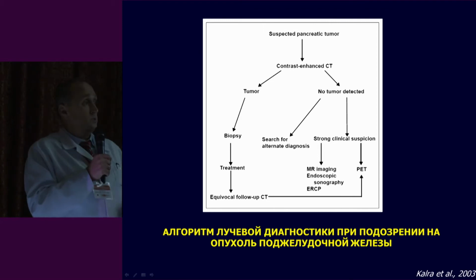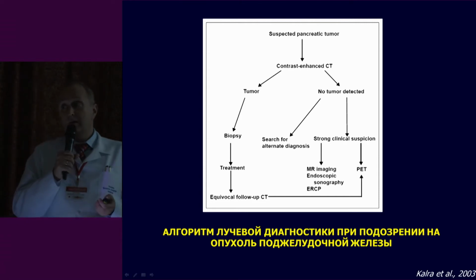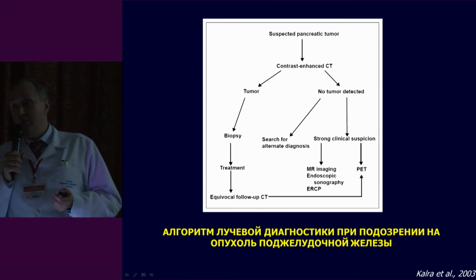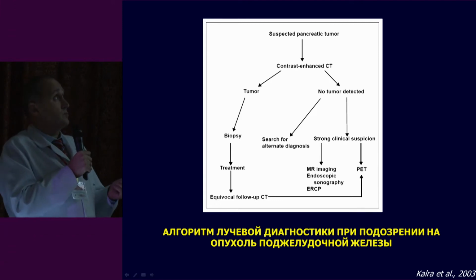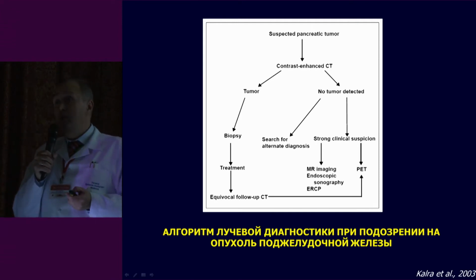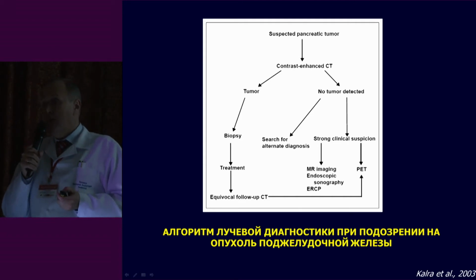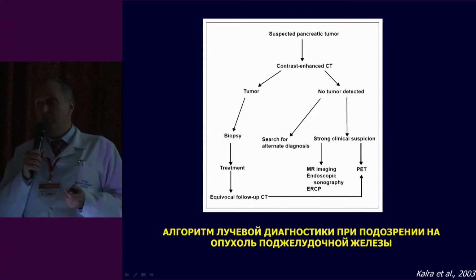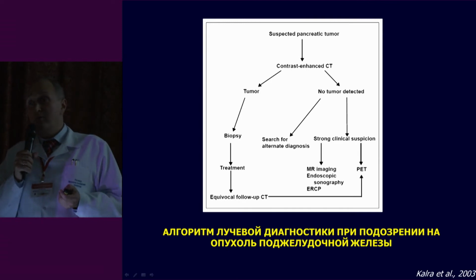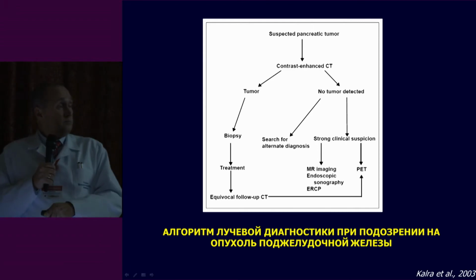And quite naturally, about 10 years ago, a brilliant Indian doctor, Kala, proposed a diagnostic algorithm, which in our institution is also implemented and which is still topical as of today. You can see that first and foremost, we can see CT with multi-phased contrast enhancement. And this is the gold standard of radiodiagnostics of tumors and malformations of the pancreatic gland. So I would like you to remember this, because when tomorrow we speak about the biliary tract, the concept will be slightly different.